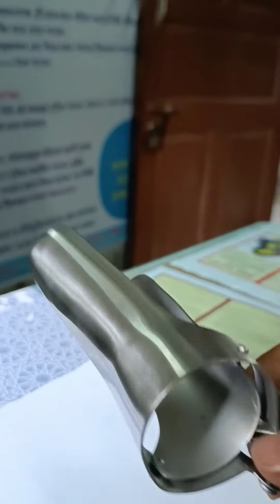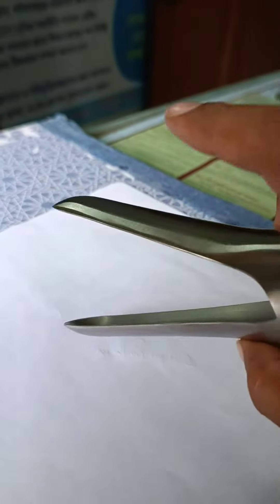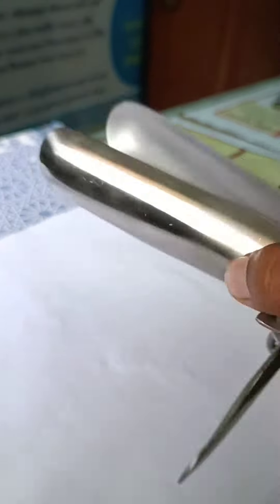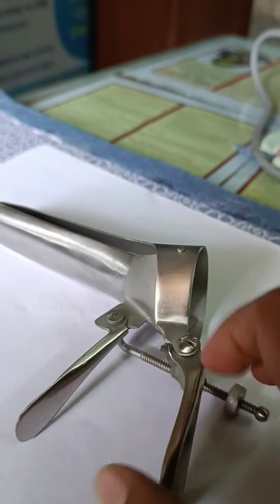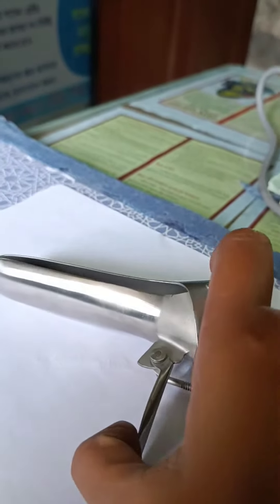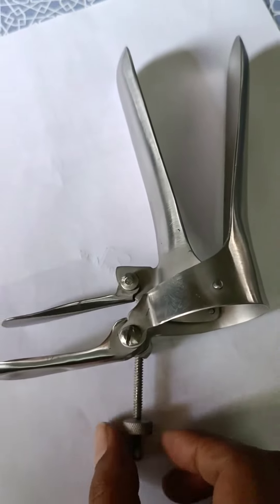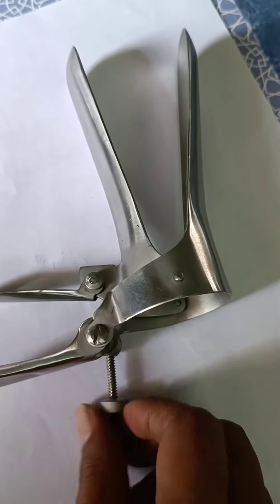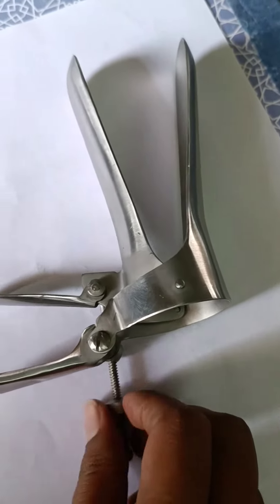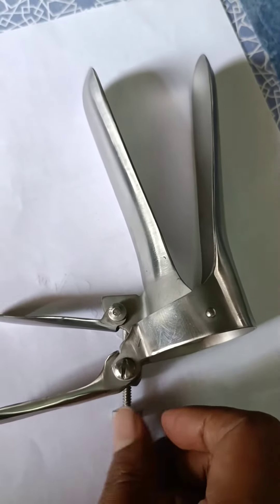This is the two-valve design — bivalved. This is the handle for maintaining grip, and this is the opening handle used to open the speculum. When you fix it into the cervix, you can secure it using this screw, making it self-retaining.